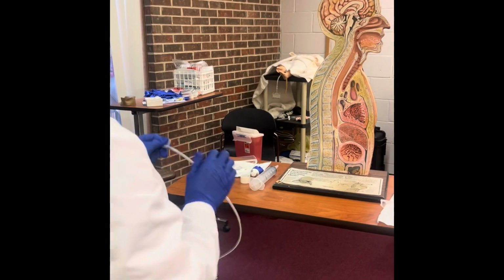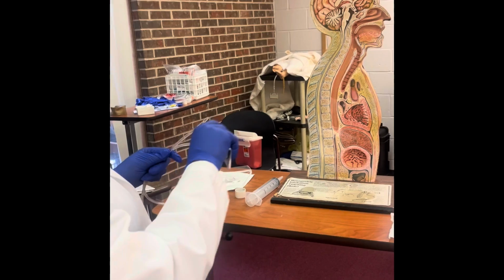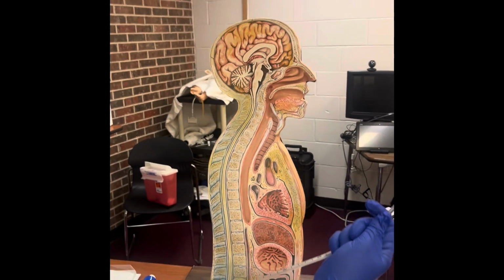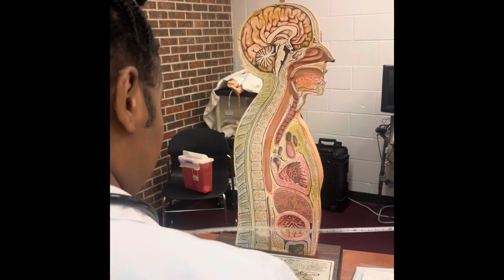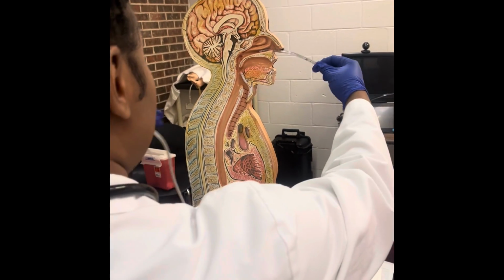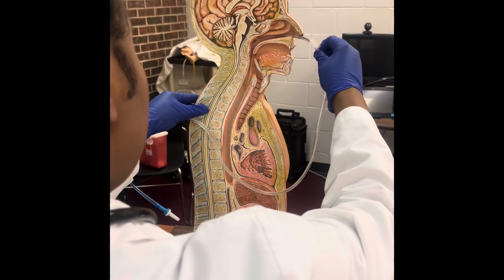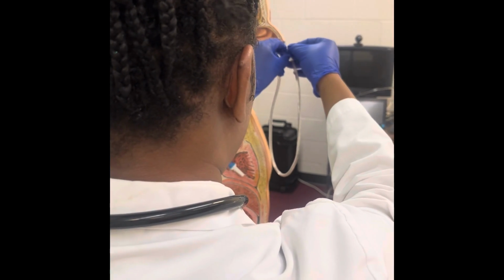Okay, and then before I insert it, I can lubricate the NG tube as much as possible so it's comfortable for the patient. Okay, as I insert, sir, I want you to try to swallow or take small sips of your water or ice chips if you can, okay? Thank you. All right, swallow. All right, and stop at where I marked my tape. I can remove my tape.